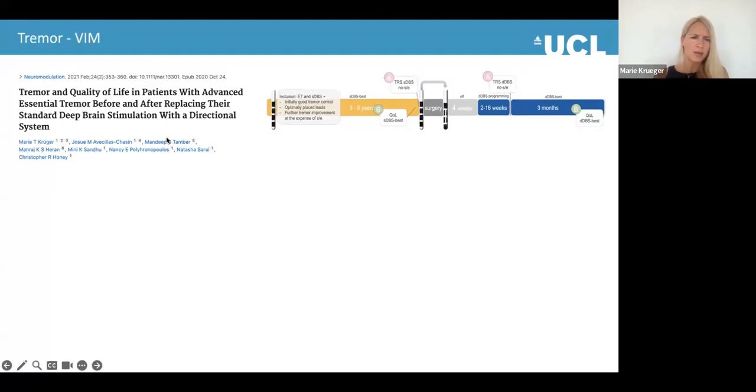This is from my time in Vancouver with Chris Honey and his team. We had 6 patients with bilateral VIM DBS who had a standard electrode, and they initially had very good tremor control, with optimally placed leads. We did get further tremor control, but only at the expense of side effects.